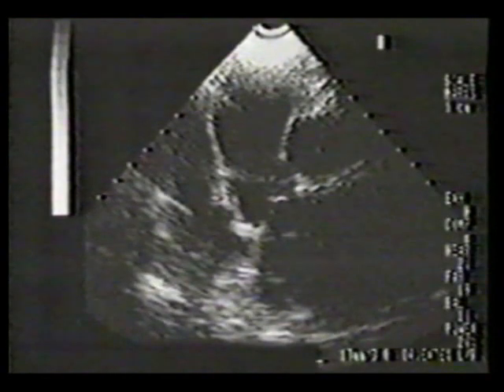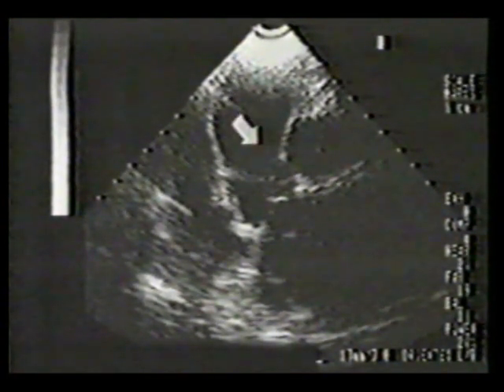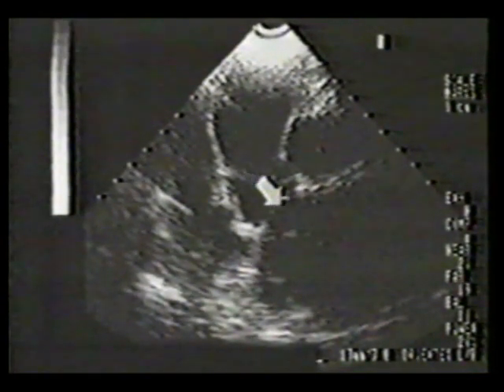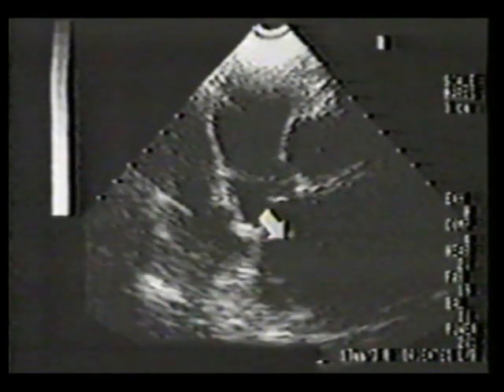An attempt can be made to more completely visualize the aortic root and ascending aorta by angulating the transducer anteriorly and to the patient's right. In this subject, the entire ascending aorta is identified, all the way to the aortic valve level. A small portion of the left ventricle is also seen.